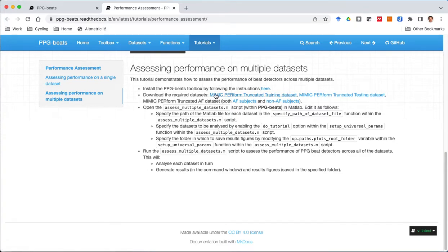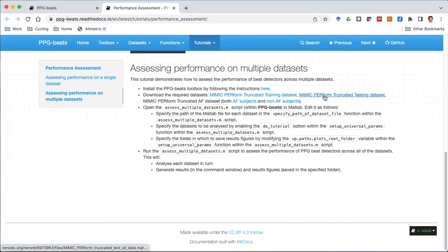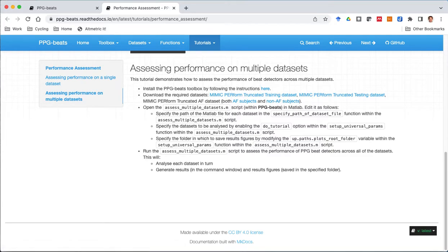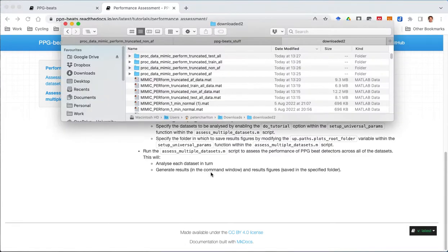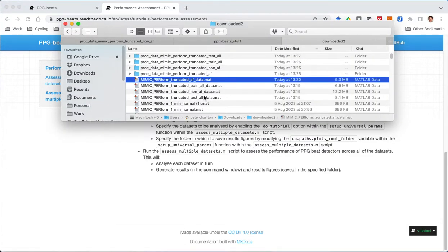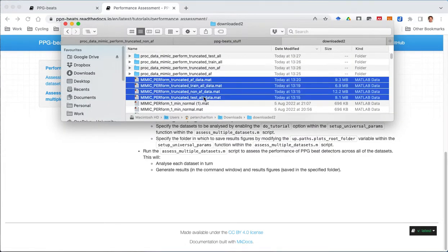The second step is to download the four datasets that we'll be using in this analysis. I've downloaded those already and they are these ones here.